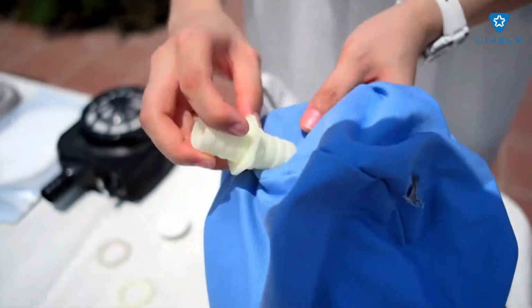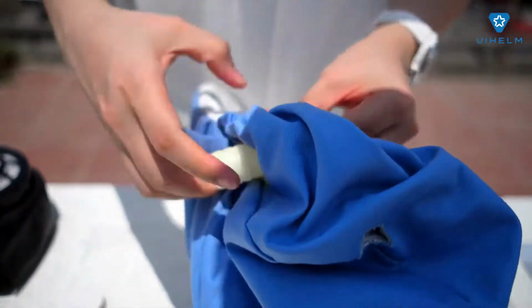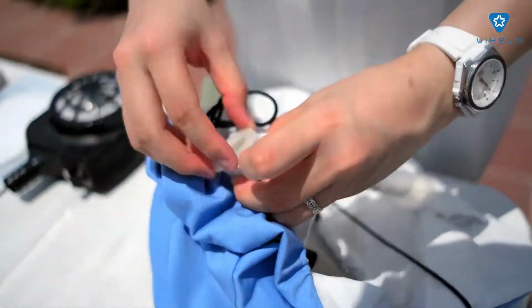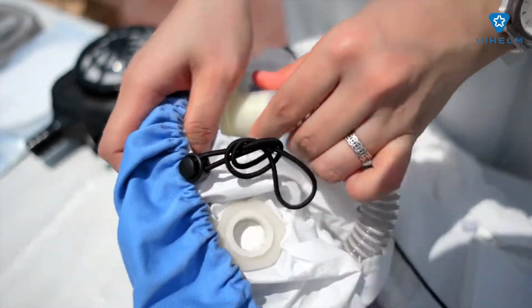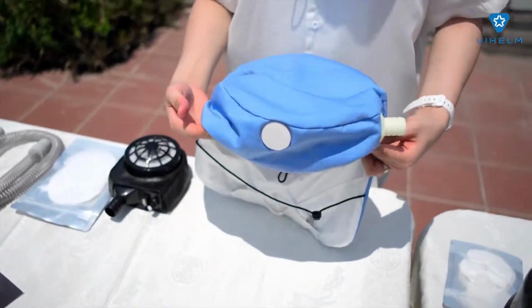Step 2. Change the position of the air hose plug to the connector. Turn the nut of the connector in the air hose plug clockwise to close. Make sure the nuts are securely tightened. Step 3. Reattach the air hose in the hood with the connector for continued usage. Next, we will proceed to assemble the air filtration system.